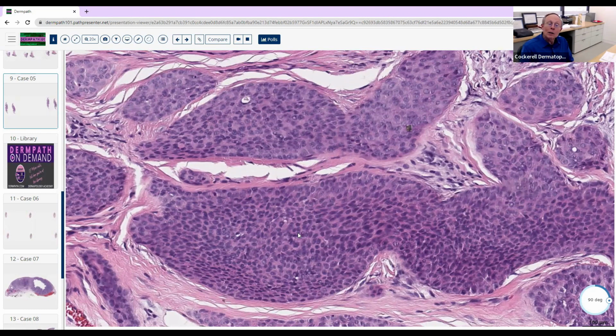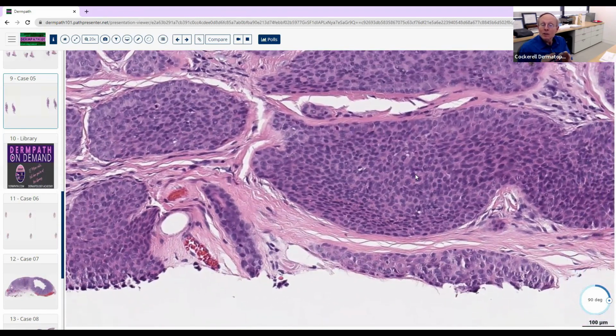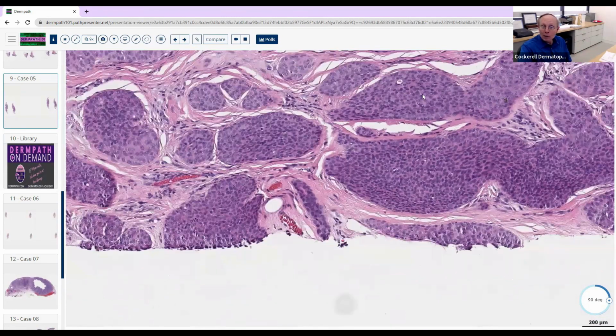Okay, so now we look at these cells, they look pretty round, small, cuboidal. They look like little clones of one another. What do we think of there? What kind of differentiation do we think of when we see the cells are round, basophilic, cuboidal, and they look like clones? The poroid cells. Good, poroid. So you're in the family of the poroid neoplasms now. So you've gotten it into that little category pretty quickly. So benign neoplasm, poroid differentiation.